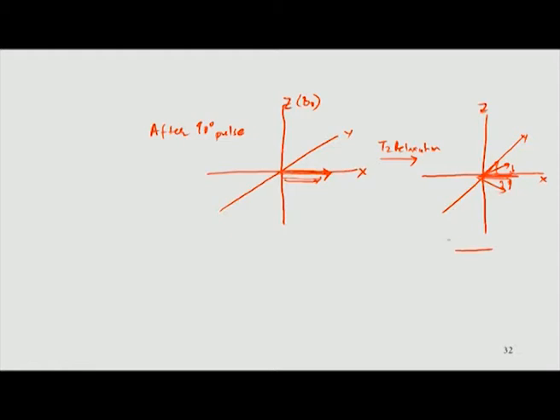So, if the initial magnetization is this much, after some time the magnetization has become this much. This is because it has reduced because of T2 relaxation. This reduction is happening because the spins are moving away in all directions in the xy plane, and because of this movement the total vector addition of the spins is now reduced.